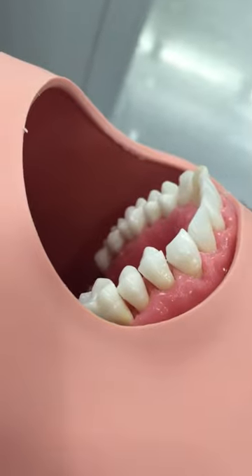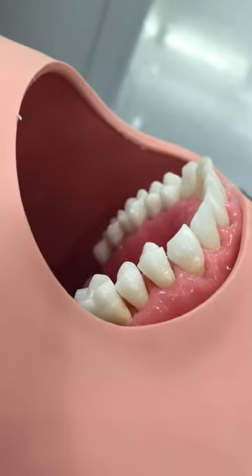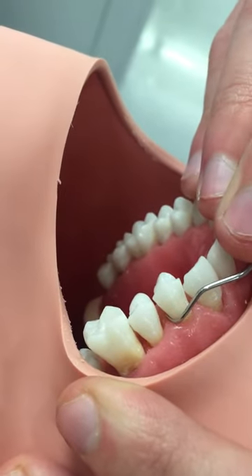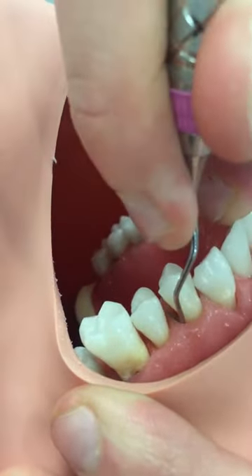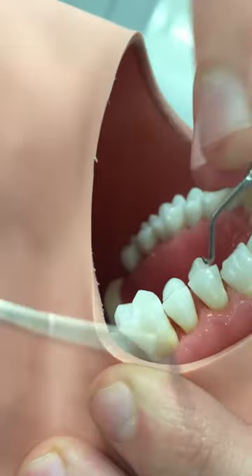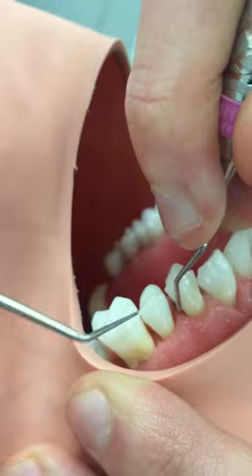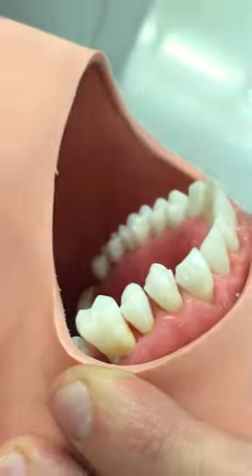We're going to do the distal buccal aspect of tooth number 12. You can see that you're going to want to put it in at a zero degree, but when you stand it up to do the working stroke, this first little bend is facing the distal, and that's going to be true anywhere in the mouth.